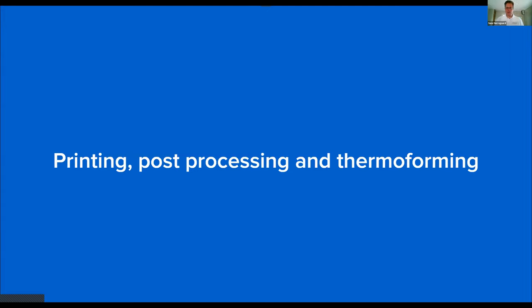We are thinking about implementing that into the software in a coming update version of it. I don't think it's going to be before we have it actually on Dental Desktop. But yes, we do get that question quite often. But again, simple CAD tools can do it. And yes, they can be hollowed prior to 3D printing.